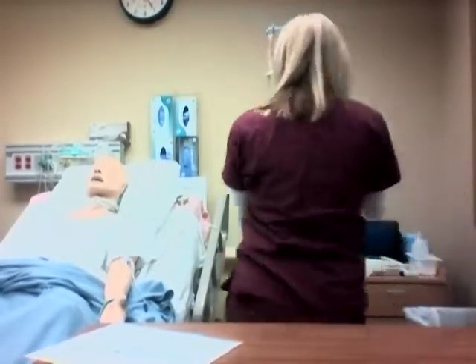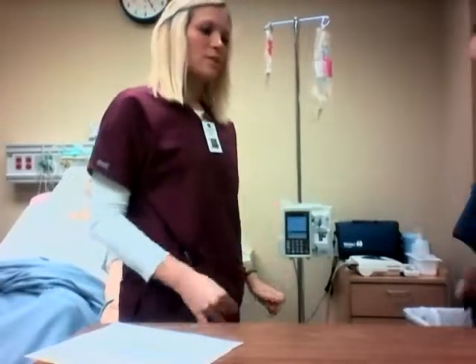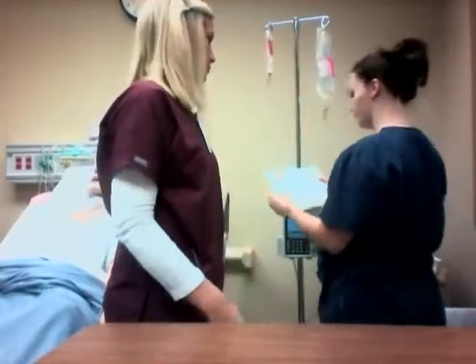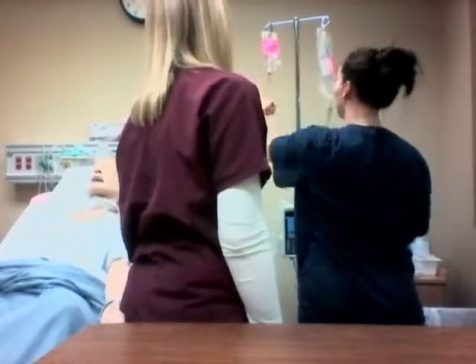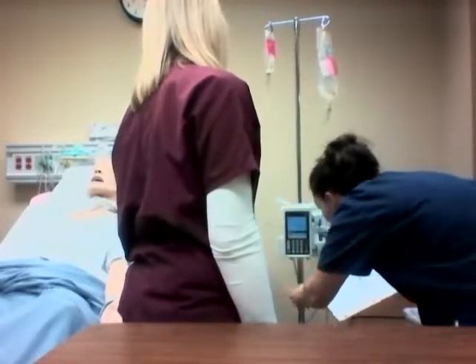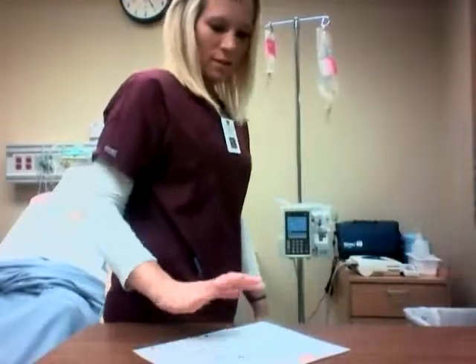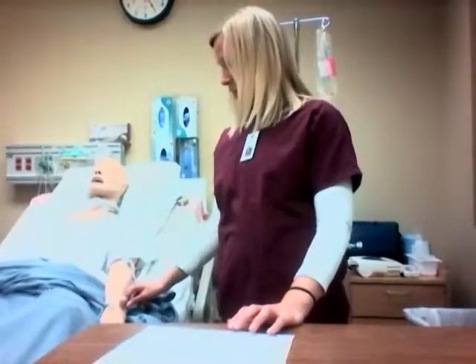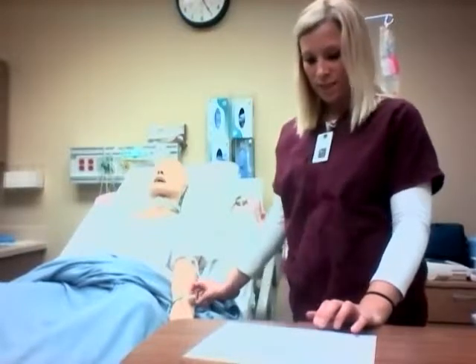Okay, so before I go ahead and start this medication, I'm going to have my second RN check this and make sure that it looks correct. So I'll have Kathy look at it. Here's the patient's MAR. Cardizem. 10 milliliters per hour. And you have the name on there. Perfect. Okay, so I've had my second RN check this. I'm also going to double check the wristband before I start anything, and I have Pat Smith. Date of birth is December 16th.